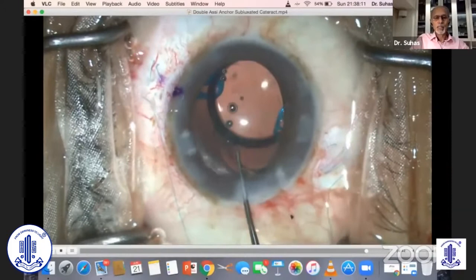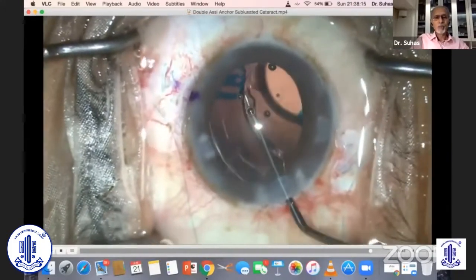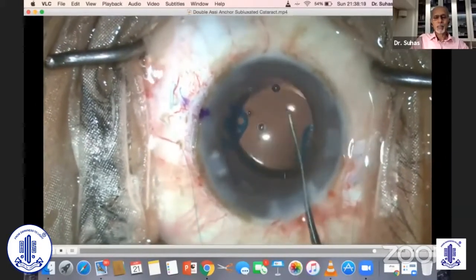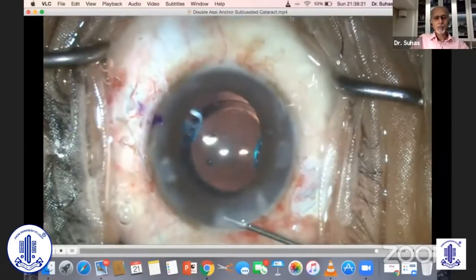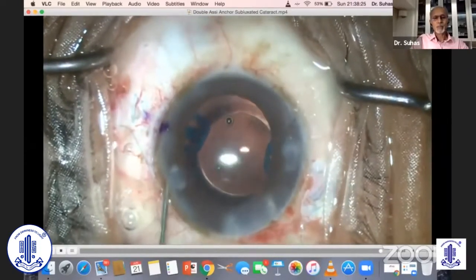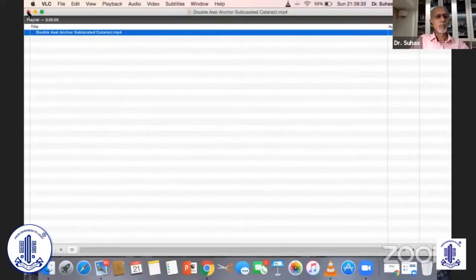Then in an inflated bag you insert your lens. Be careful when you put in the trailing haptic. Once it is done, the lens is placed well in the center — and that's about it.